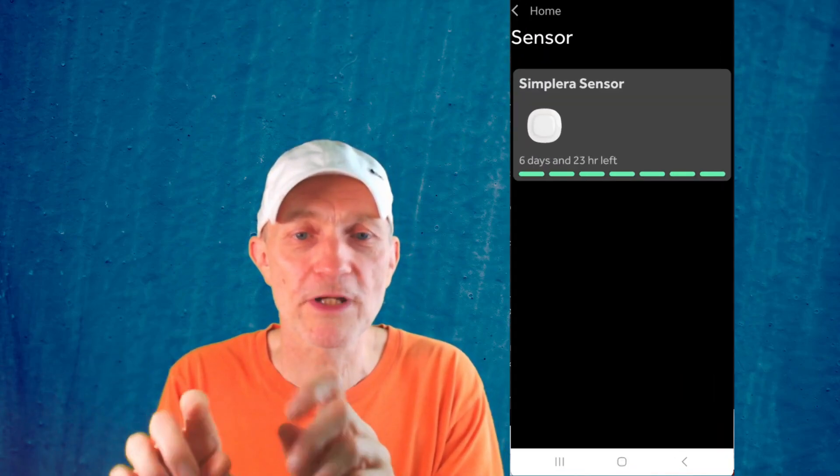It's great that you can calibrate this sensor to your finger-prick blood tests. However, getting to the calibration entry in the app is not as easy as on the Dexcom app. On Dexcom you simply enter blood glucose and the app asks if it's for calibration or logging. With the Simplera, you need to tap the sensor symbol, then a dialogue appears, then tap an options button, then tap 'enter blood glucose,' and only then does it say 'calibrate.' That's quite a few sub-menus.